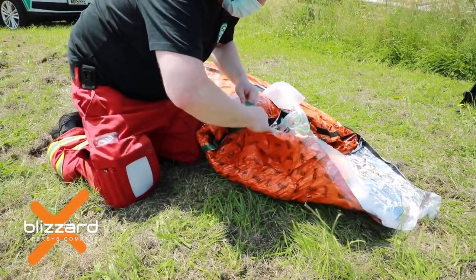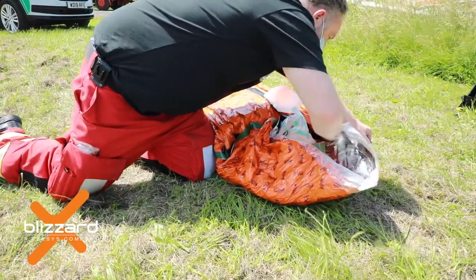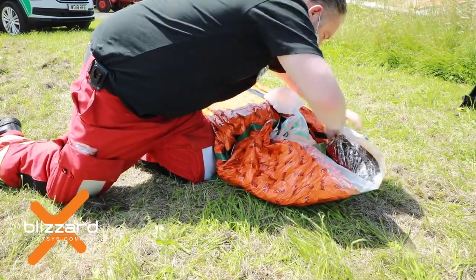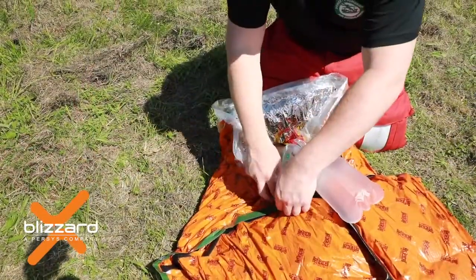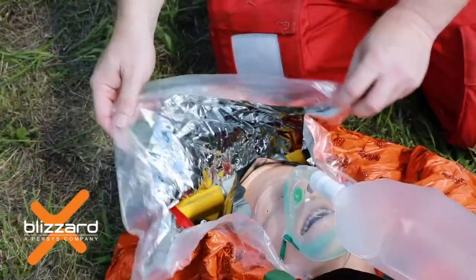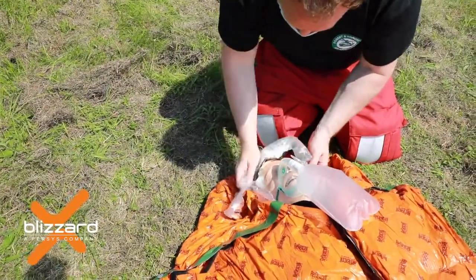If further closure is required, fold over the integral hood from behind the casualty's head and join to the opposing hook and loop closures on each side of the shoulder area. Tuck excess materials and close off any open gaps around the shoulders, neck, and sides to ensure a snug seal around but not covering the face.